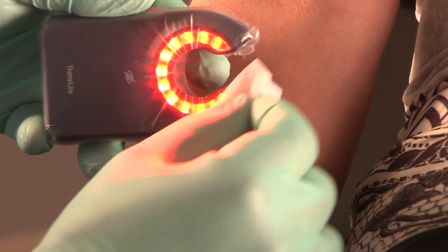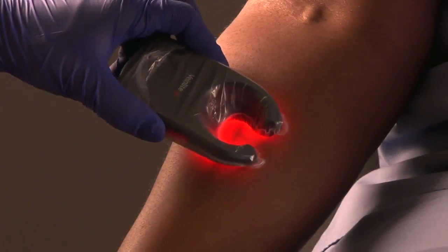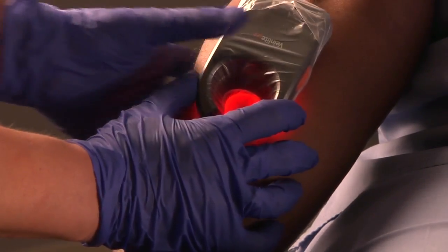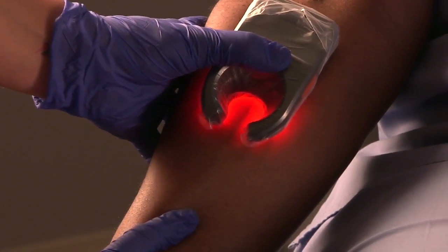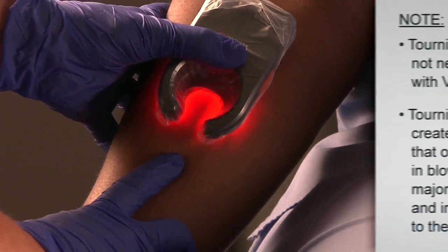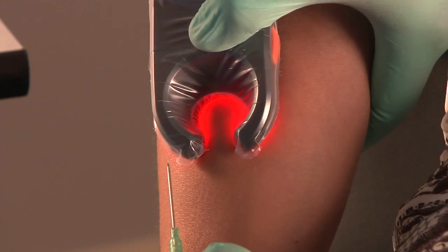Your VeinLight device and access site must be prepped in the same manner as any other IV access procedure. Rotate the device with the opening facing you. Place your thumb on top of the VeinLight, wrapping your four fingers around the limb. Gently squeeze the VeinLight into place. This action helps isolate the vein and provides optimal pressure for access.